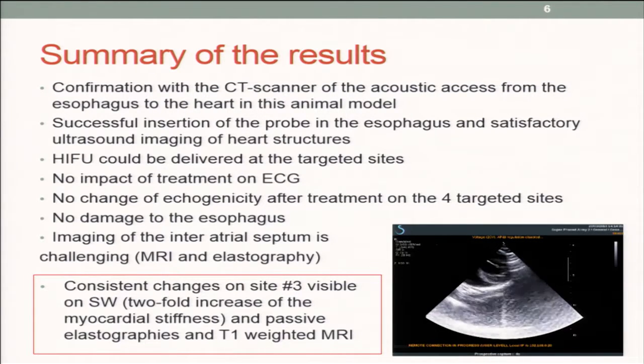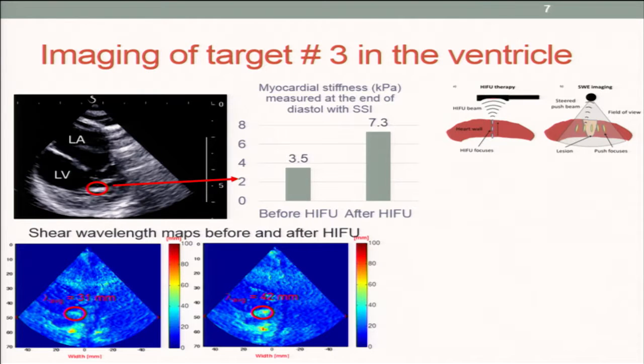The most interesting result was observed on the third lesion — as you'll recall, it was in the ventricle — where we observed consistent changes in terms of stiffening. And also, as you will see with MRI, some hypersignal. This is where the lesion was on ultrasound B-mode imaging.